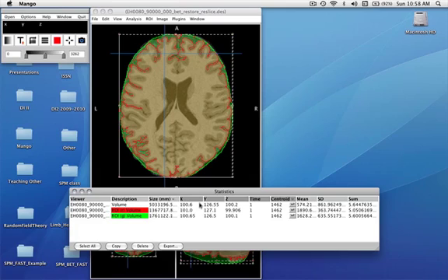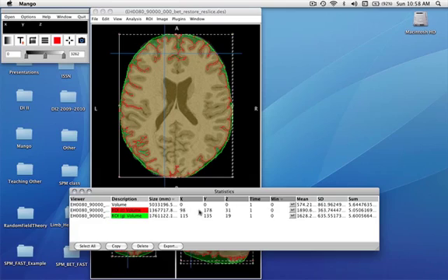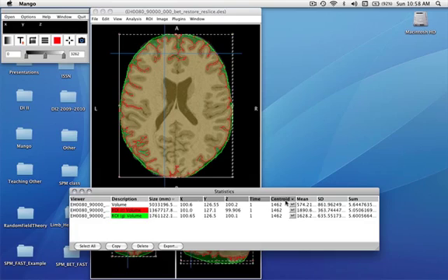Next to that are locations. These are locations for, in this case, the centroid, the maximum, and the minimum. Notice the minimum in the entire image is the first occurrence in which it saw zero, which is the very first voxel encountered. And then the first zero here is in these various regions of interest.